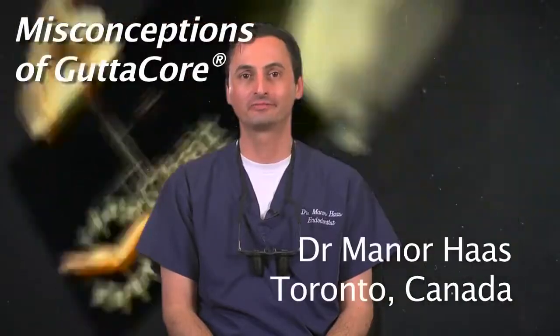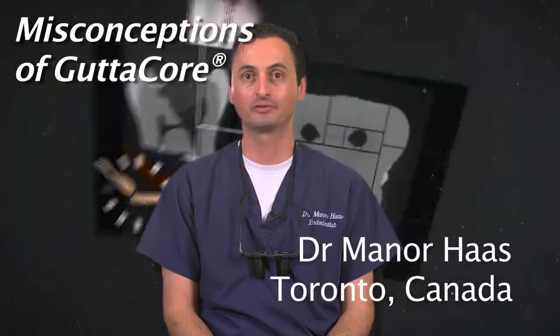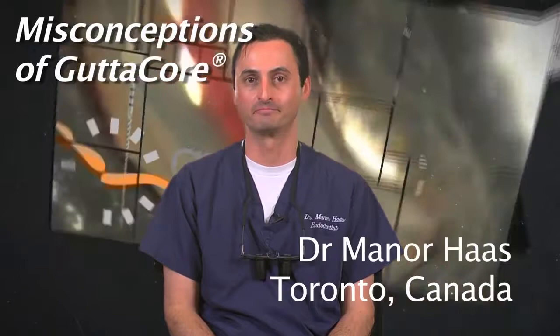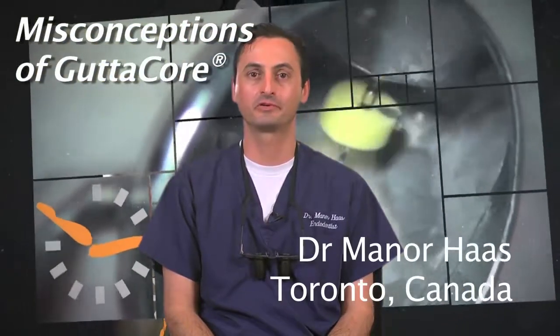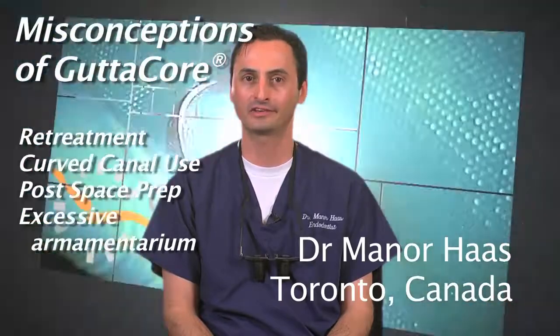Hello, I'm Dr. Menorhas, a certified endodontist from Toronto, Canada. In this segment I would like to discuss and clarify some misconceptions about gutta core obturation. These include retreatment of gutta core, obturation of curved canals, post-space preparation, and excessive armamentarium.